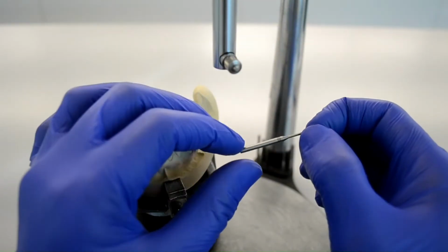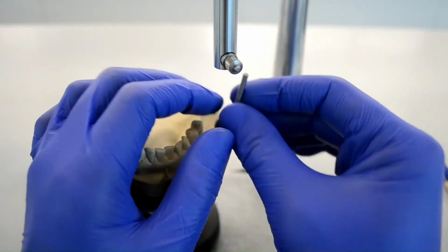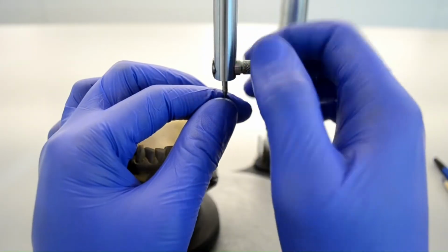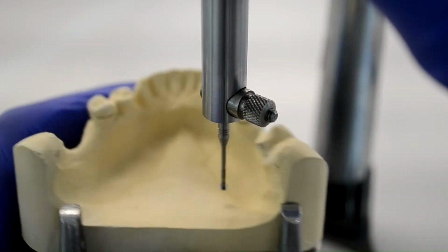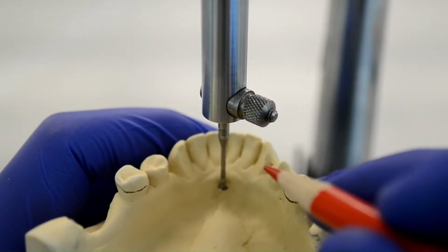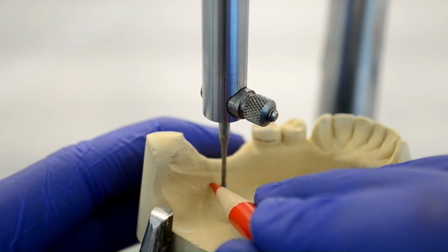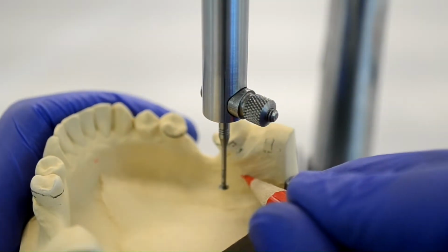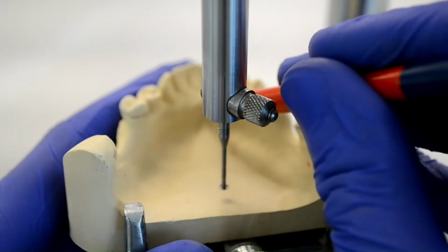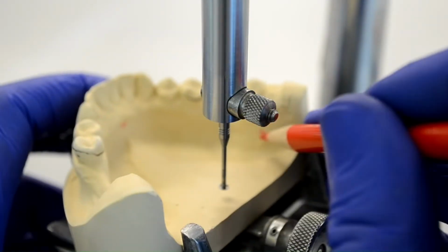With this, the surveying is completed, but in order to save the position of the cast, we need to tripod it. This is done using a .03 undercut gauge. The .03 undercut gauge is attached to the mandrel, and the mandrel is lowered so that it would allow that undercut gauge to touch the cast at 3 different areas without having to move the mandrel up and down. A red pencil is then used to mark each area of contact with the undercut gauge on the 3 different points on the cast. And red circles are added for easier visualization.